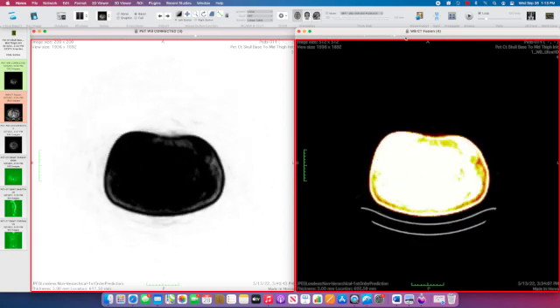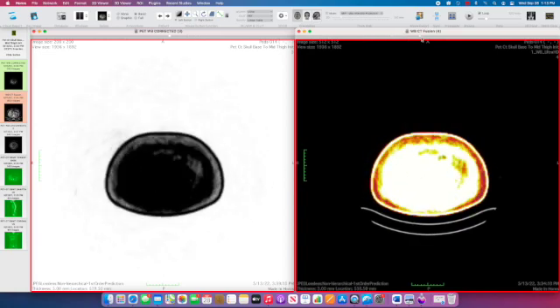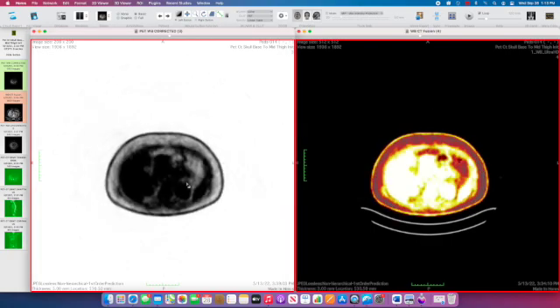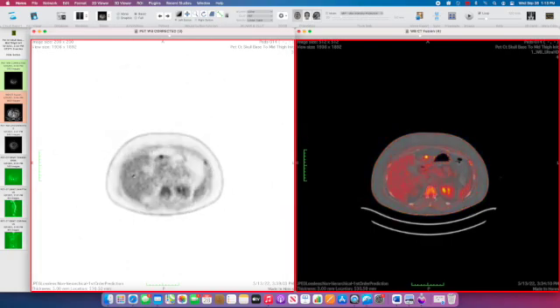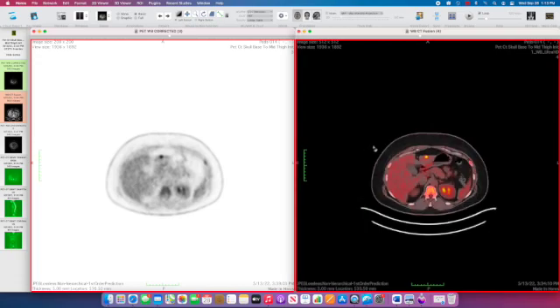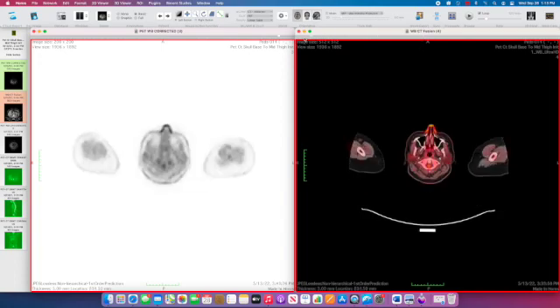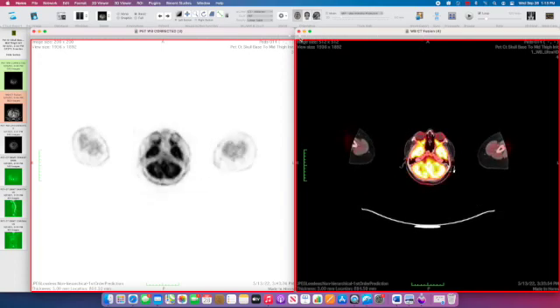I'll go down to around where the liver is and then change the PET window so that the liver is sort of this light gray color. Now I can go back to the top of the study and start to review the images.